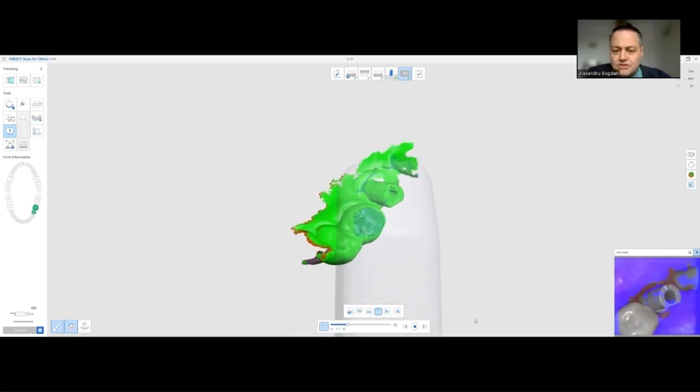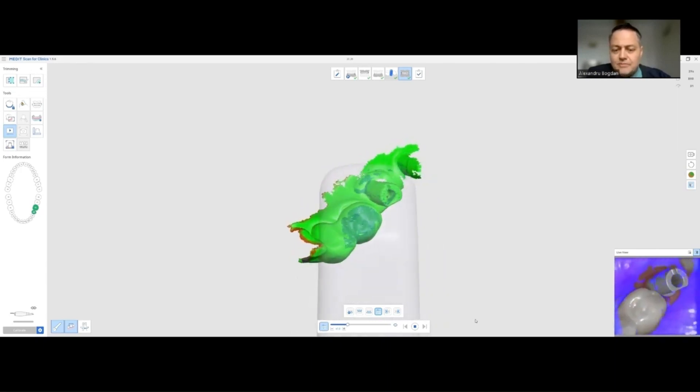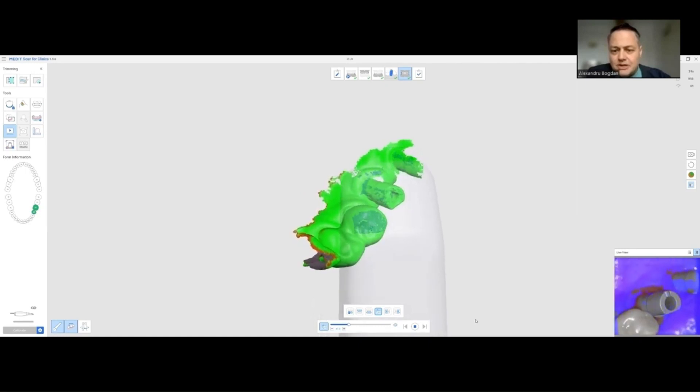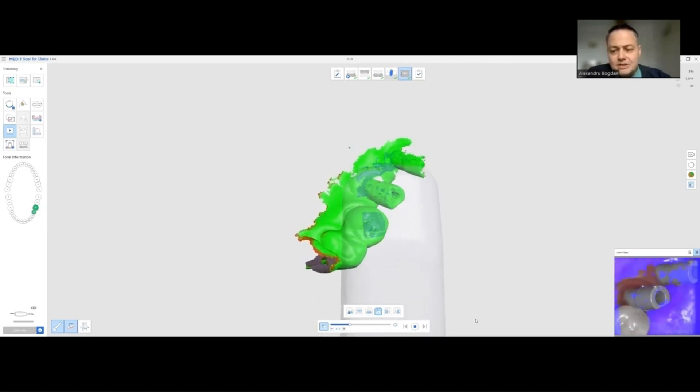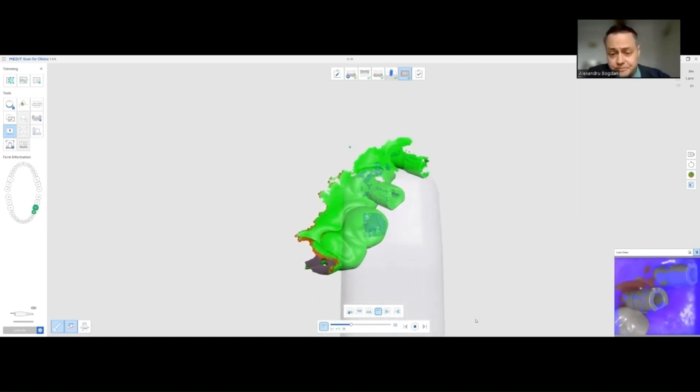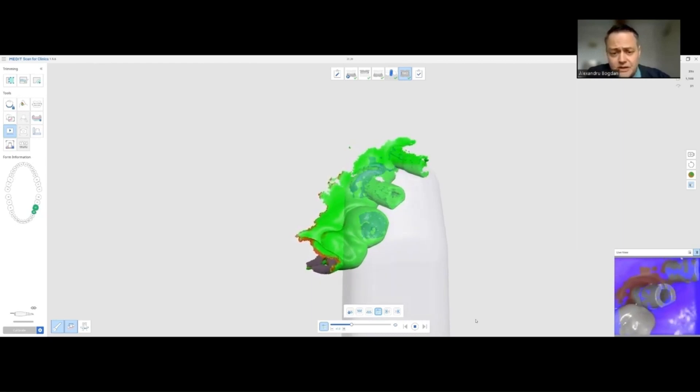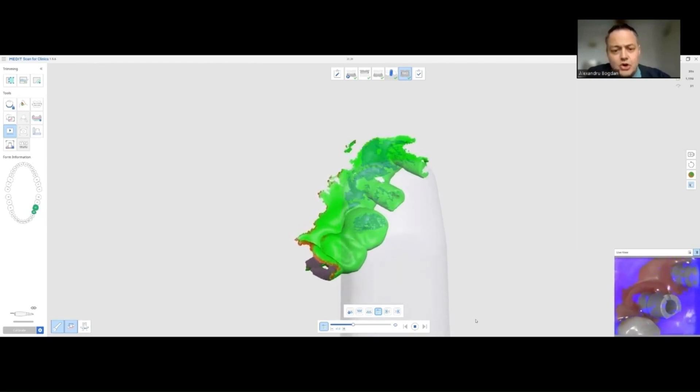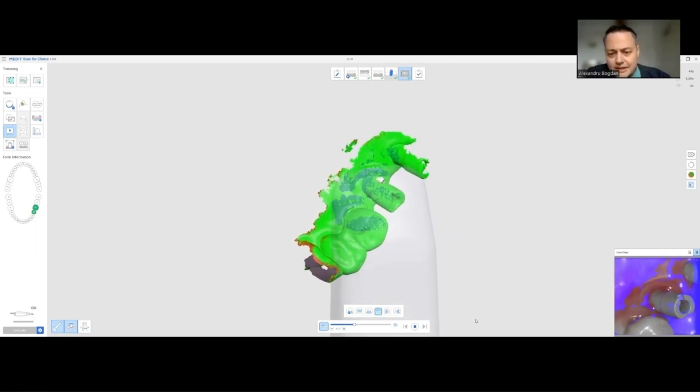Why I do this is because the teeth are completely green and they will always act as a guarantee that the scan bodies are correctly scanned.